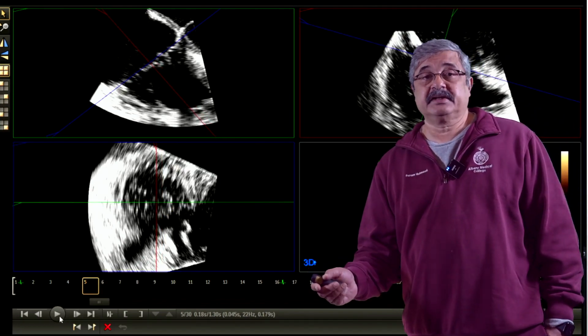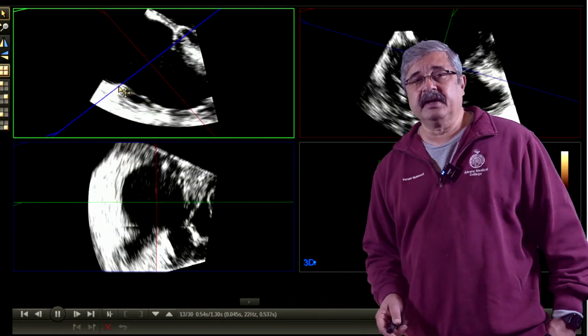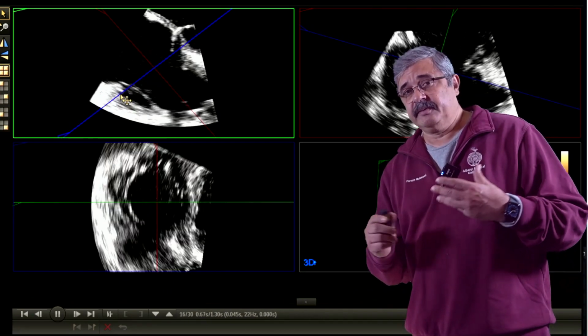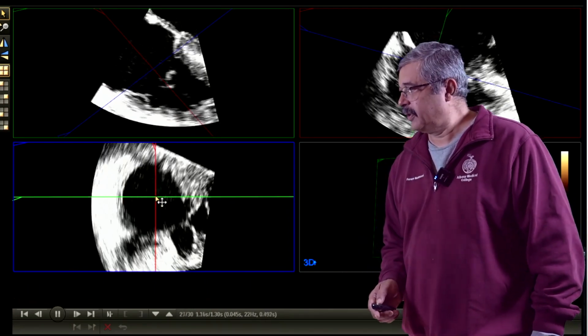specifically where the regurgitation is coming from, or is it amenable to any surgical intervention and what needs to be done. So this is something that needs to be done with practice, and once you're getting used to it, you tend to know that pretty well.